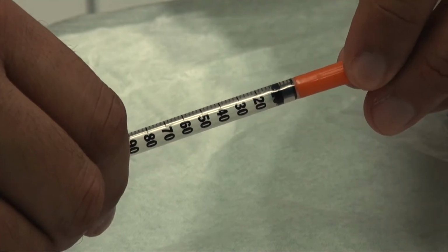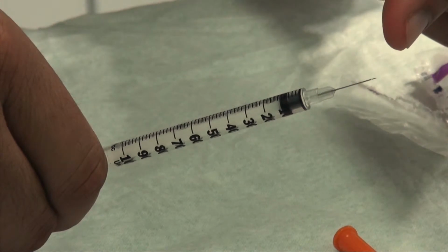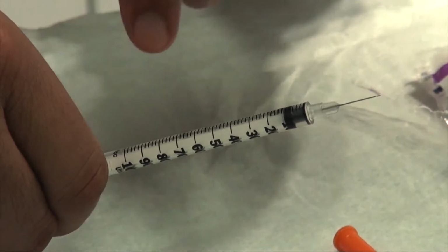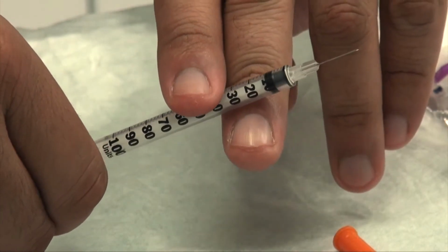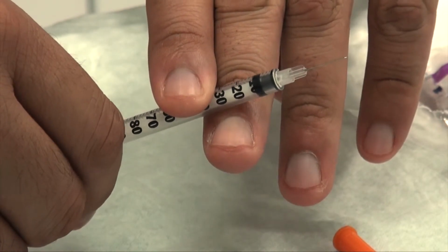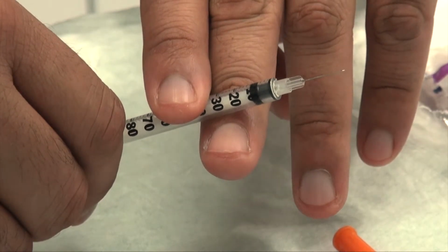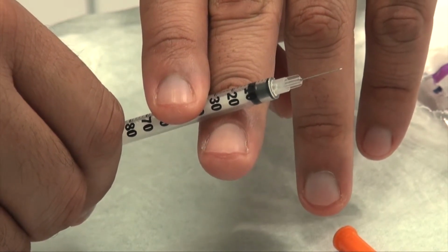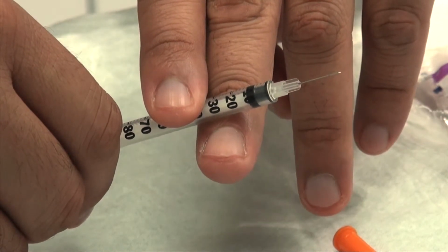So here we have the 1 ml insulin syringe, and if I uncap it, as you can see, it has a reasonably long 12.7 millimeter needle, and this is a 29 gauge needle. Now, the smaller the gauge of the needle in number form means that it will hold its edge better on repeat punctures of the skin. Botox injection necessitates repeat punctures of the skin.